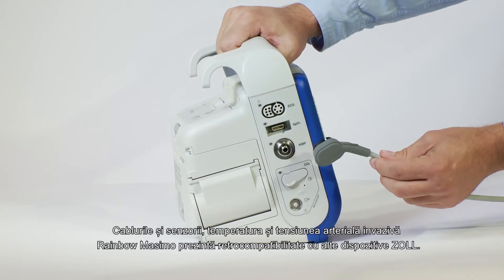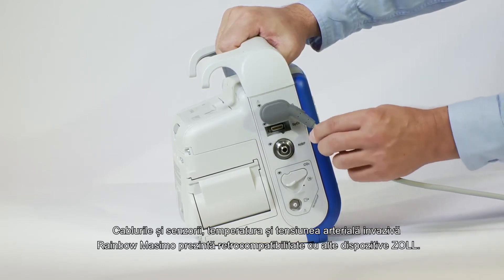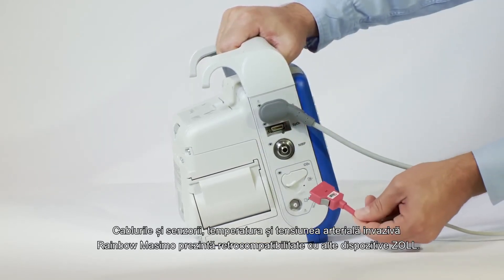The Rainbow MASIMO cables and sensors, temperature, and invasive blood pressure are backwards compatible with other Zoll devices.